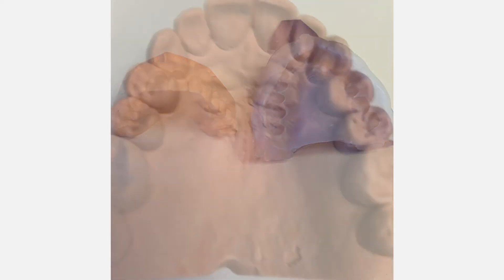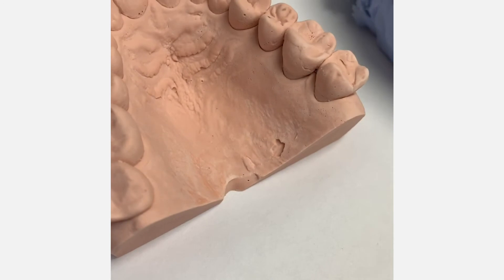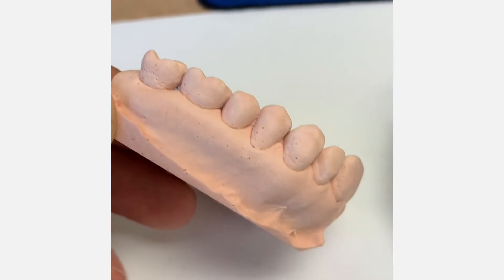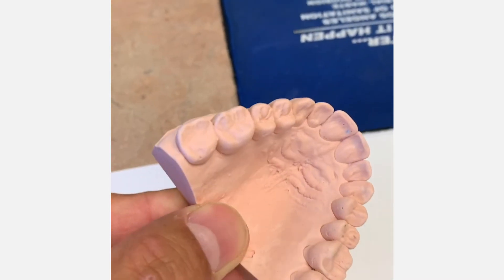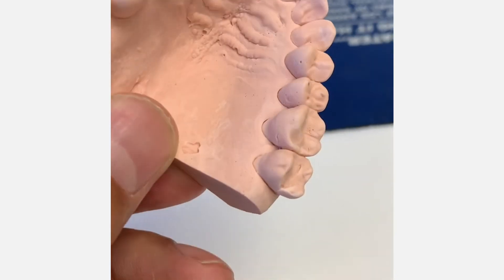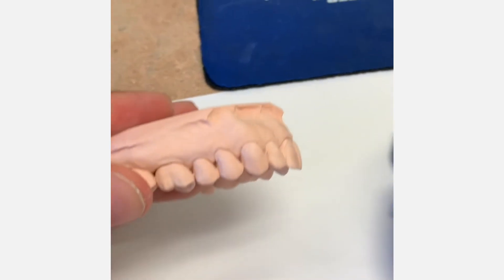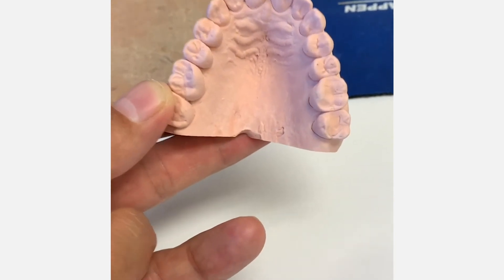Take a look at the great detail of this impression. This was just a very fast, quick pour-up but I wanted you to see how detailed that impression is — even all the way back in the distals of the terminal molar. It almost looks like I even packed cord, that's how great the detail is. I'm really happy with the way this turned out.